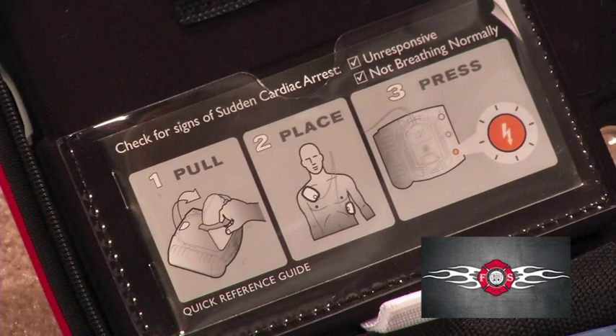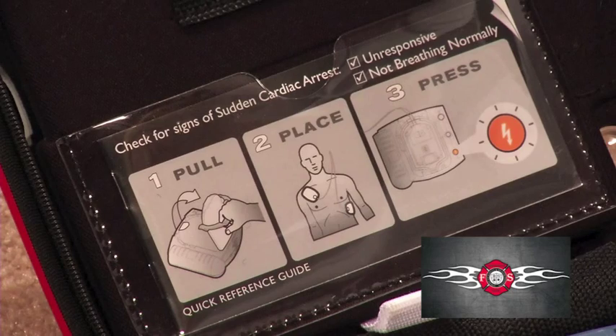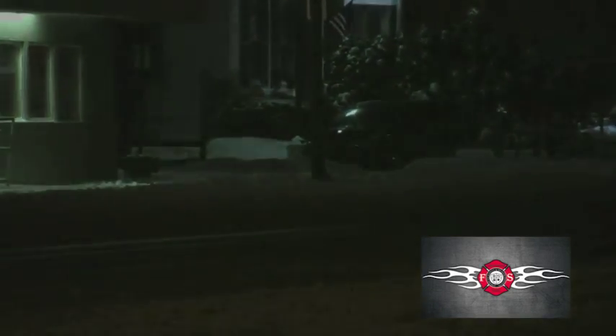That's it — just do what the AED tells you from the moment you turn it on. When the emergency medical team arrives, you may have saved critical time by starting treatment. Even better, you may have saved a life.